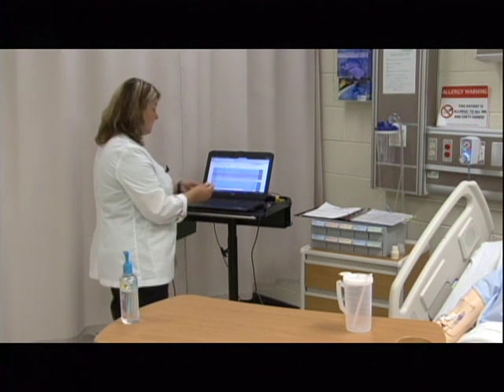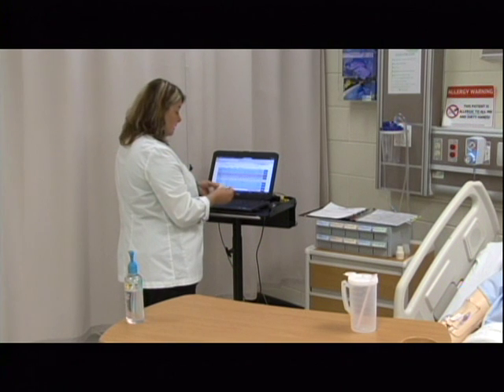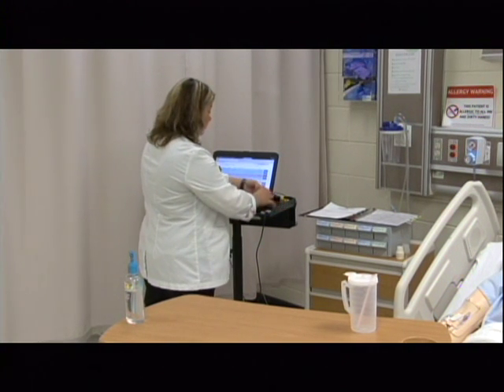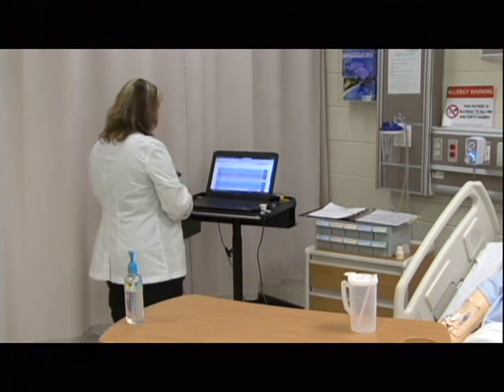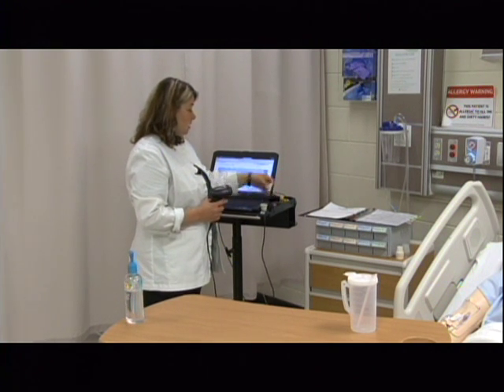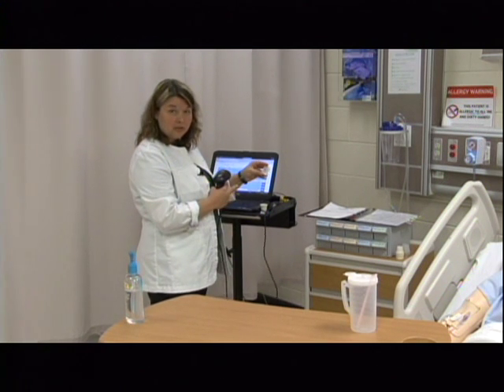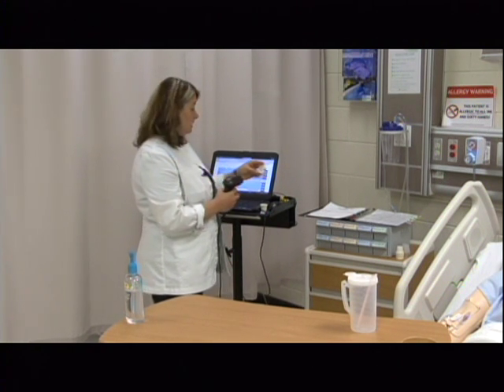I have confirmed the first check here as I'm looking and I'm pulling them out and comparing to the computer. I'm now going to come back over here and perform my second check when I go through and I'm going to scan the medications. Whenever you do this, you have to make sure that you scan each medication individually. So the digoxin, I always make sure and look at the expiration date as well to make sure that the medication is not expired.